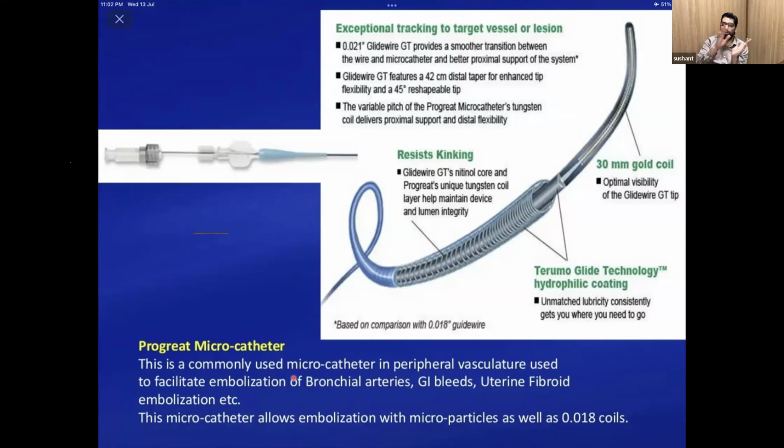But if we want to go for a prostatic artery and we want to use embolic material like 100 to 300 PVA particles, they can even be taken through a very small catheter. So a 1.9 French catheter can accommodate 100 to 300 or 300 to 500, but 1.9 French cannot accommodate 500 to 700 of PVA. So again, we cannot use a 1.9 French for a bronchial artery. So again, we need to know our target area of interest and what material we are going to use.